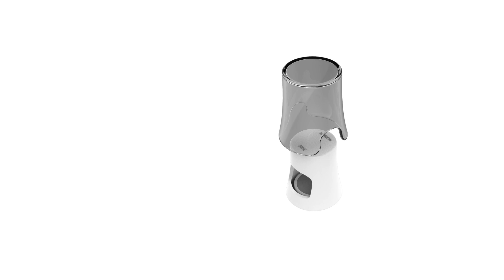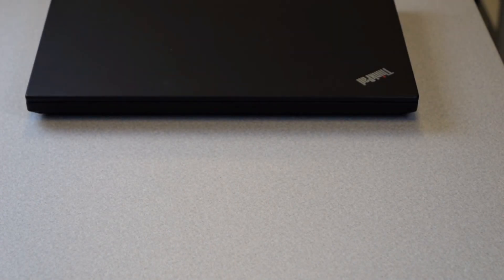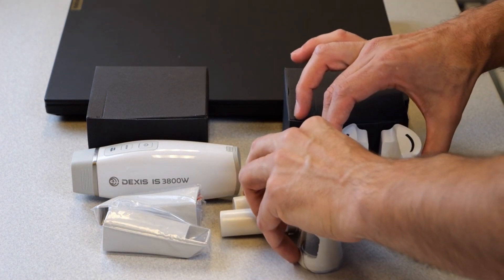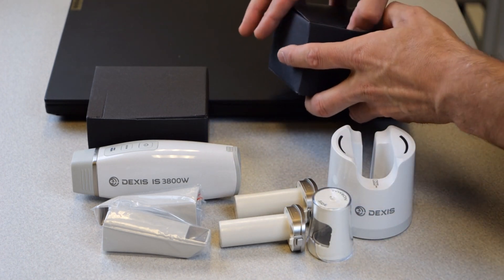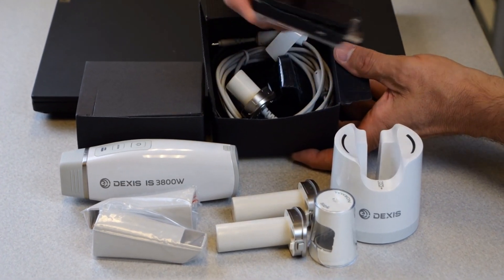See the DEXIS IS ScanFlow User Guide for more information. To set up the scanner, remove all items from the scanner case and place them on your workstation. Next, remove the TP-Link Wi-Fi dongle, docking station, and power adapter from the box and place them on the workstation.